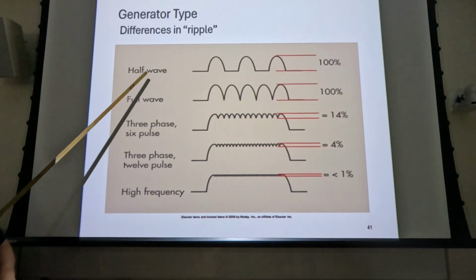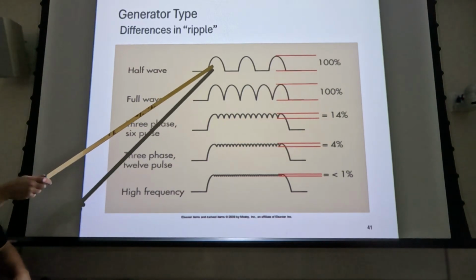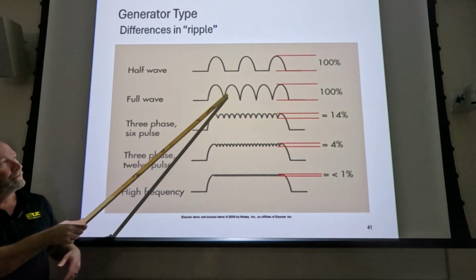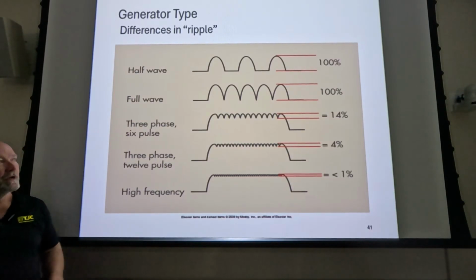So how you keep these 2 straight is how much of the wave are you using if the wave goes up and it goes down? How much of the wave are you using here? Half, right. So if we flip that negative side that should be right there up and we use that, we're using the full wave, right? So full wave rectified is what you might use.